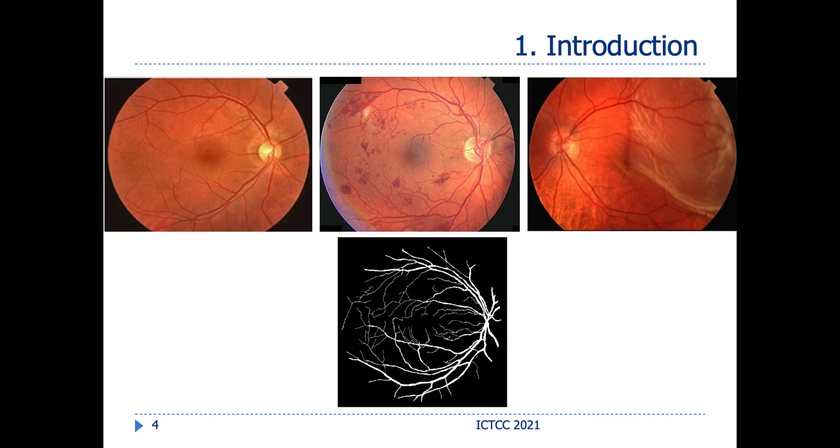The final image is the result of segmentation. From these results, the blood vessels are 1 to 9 pixels thin. To everybody, this is very small. However, with disease stratification, this is very important. Therefore, the detection and classification of hypertensive retinal images is very useful in doctors' diagnosis.